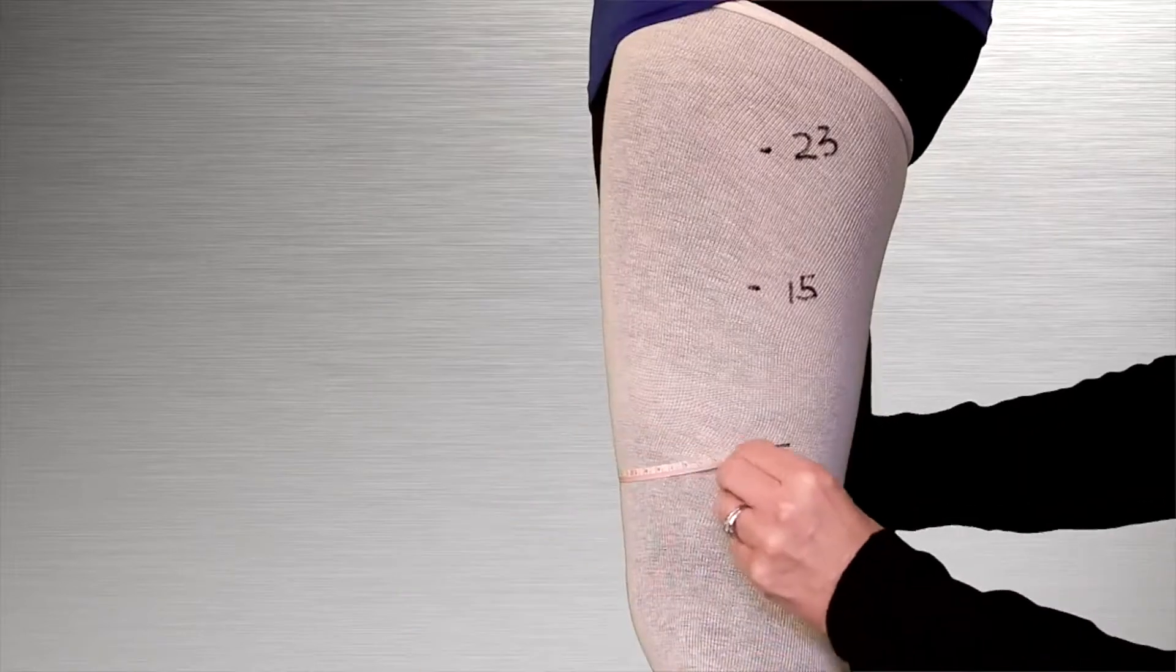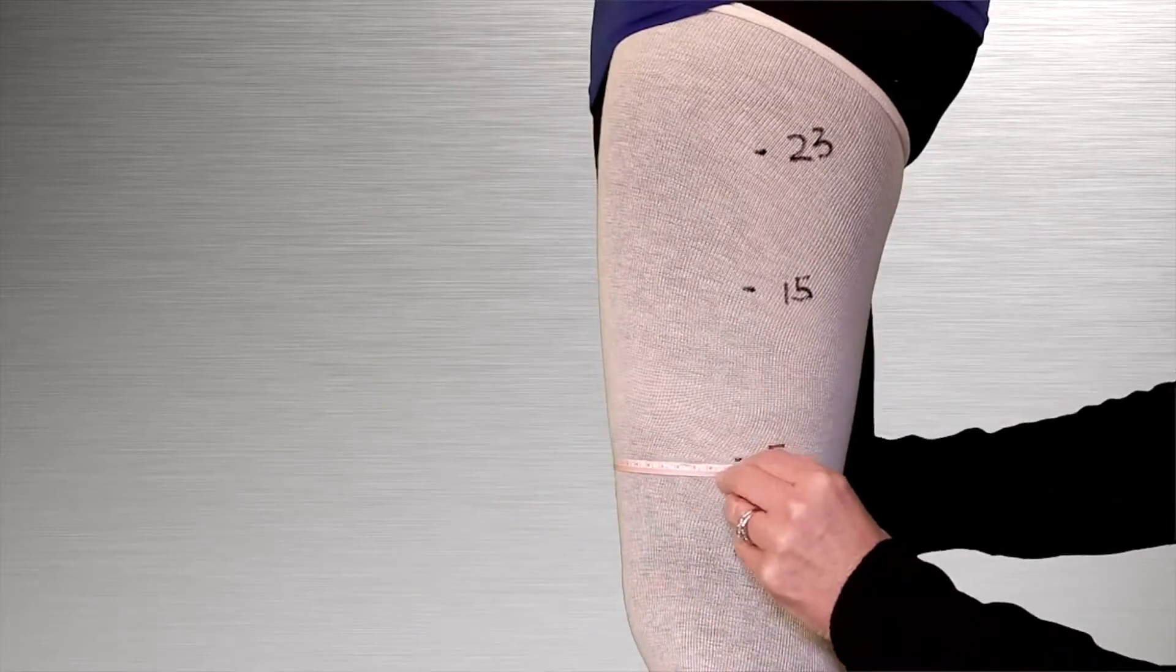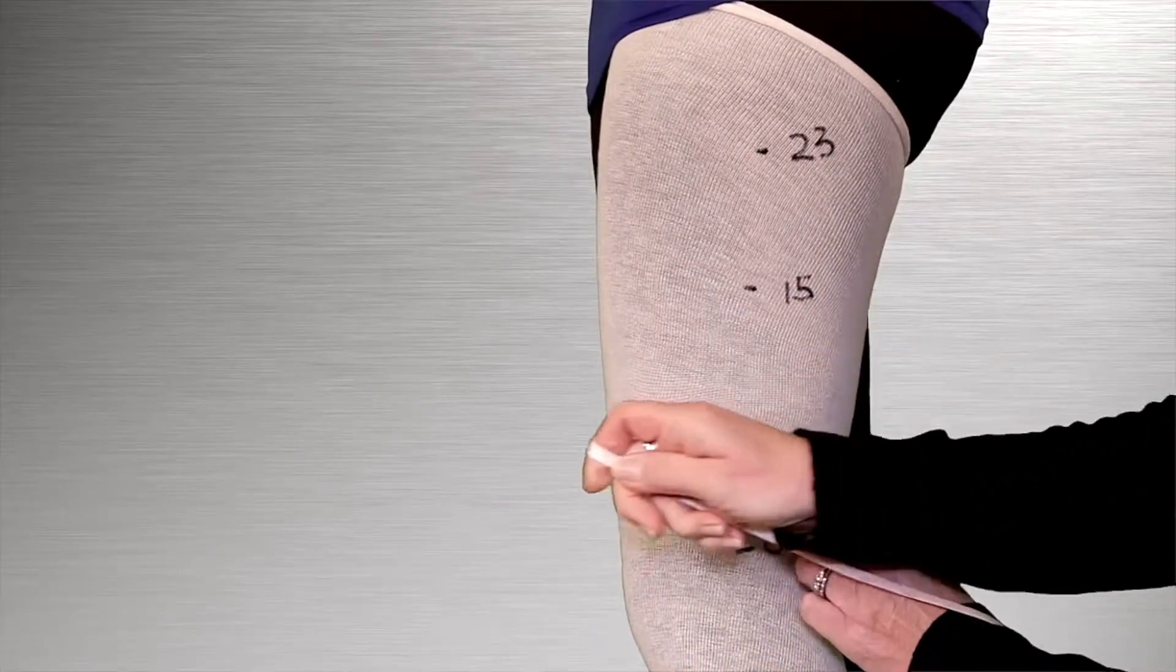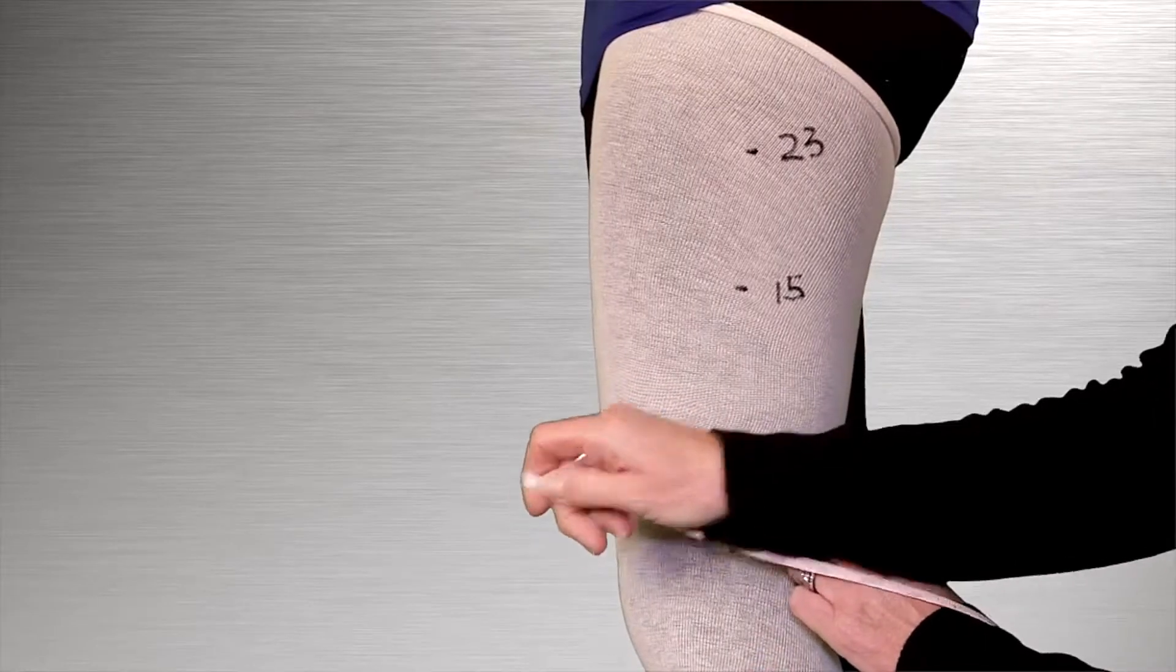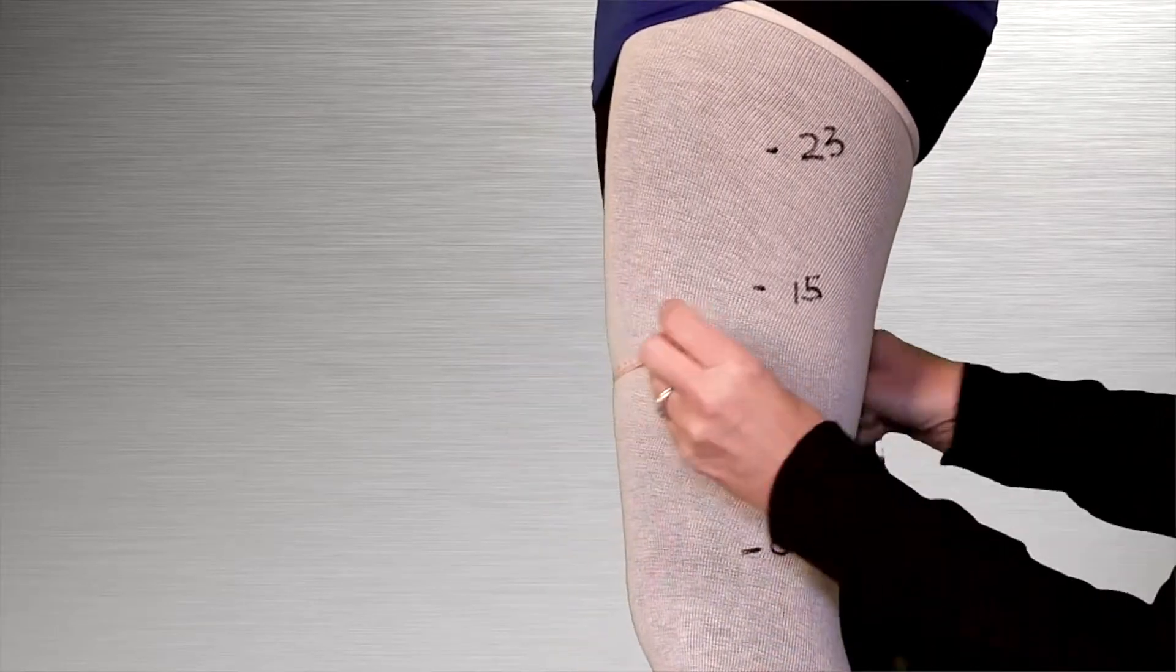Measure the circumference of the leg at the 5 centimeter location. As with all measurements, do not pull the tape tight. Apply just enough tension to keep the tape in contact with the skin.